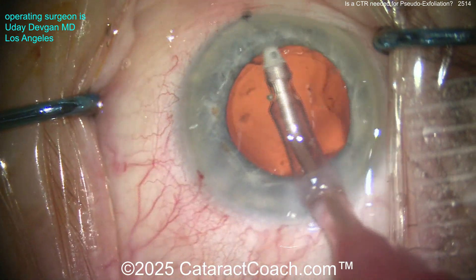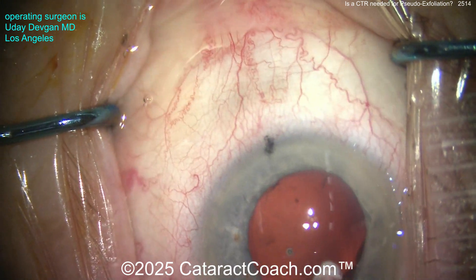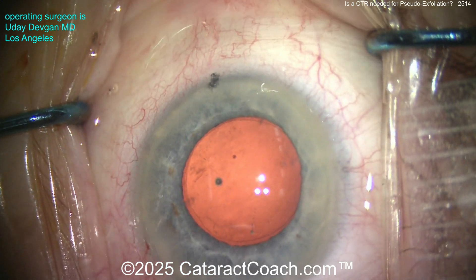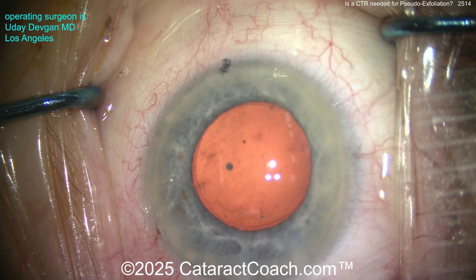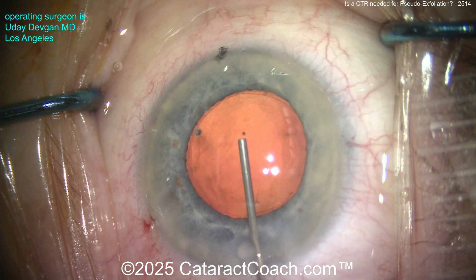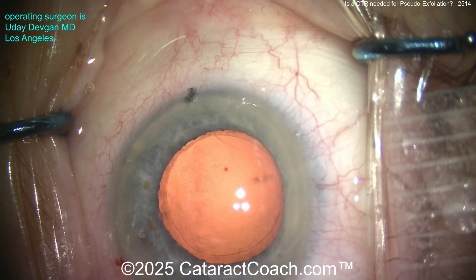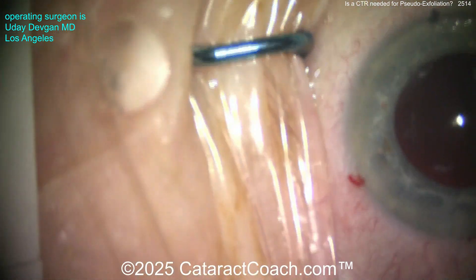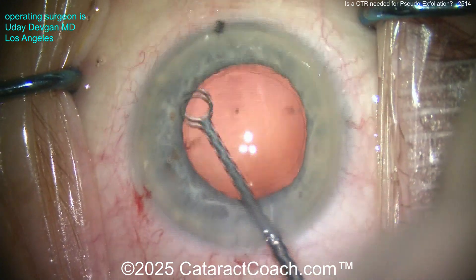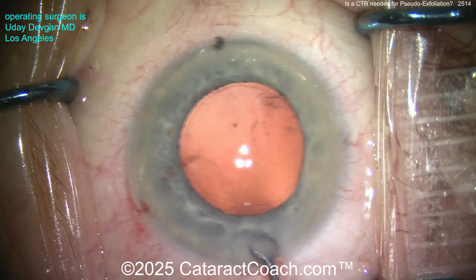Now going in for cortex removal. Notice carefully — the rhexis edge does not move. If you pull the cortex and see the edge of your rhexis moving, that's a bad sign — it means very bad zonular integrity in that area. But here it was pretty good. Let's fill up the capsular bag with a cohesive viscoelastic and do a little capsular polishing. Pseudo-exfoliation can be higher risk for capsular phimosis afterwards, so cleaning out lens epithelial cell matter from the underside of the anterior capsular rim may be beneficial.